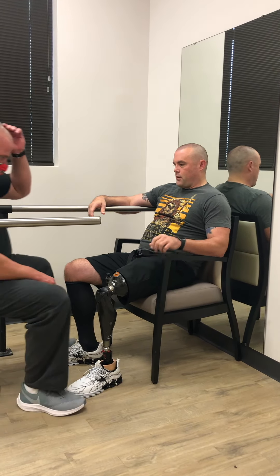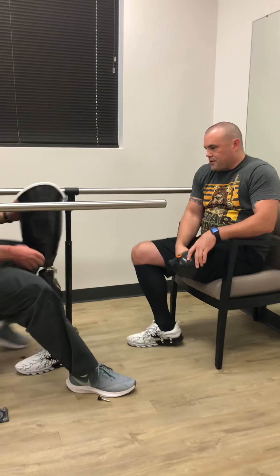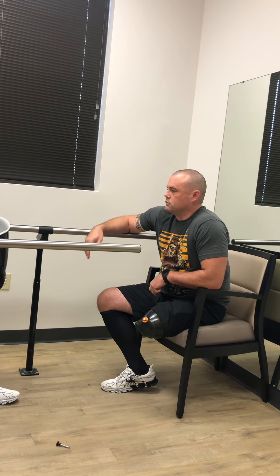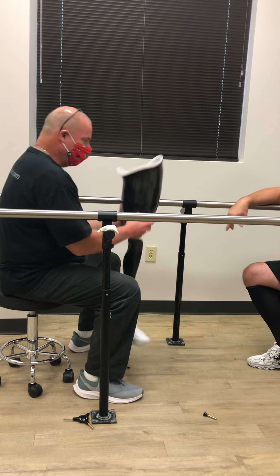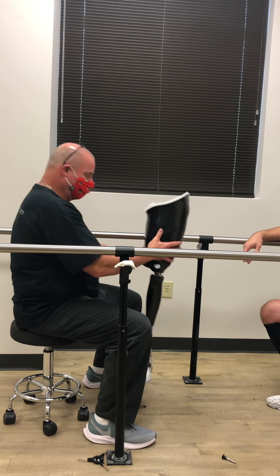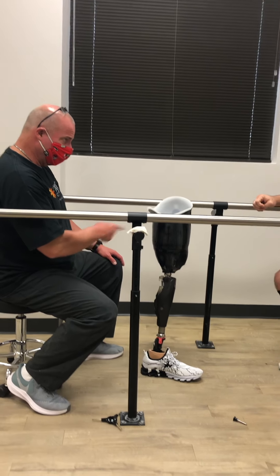You've got to take the shorts off or get it off. All you do is pop the pin and then it'll come out. Normally if you're just getting out of it — hanging out for a little while on the couch — you don't have to come all the way out of it. For 15 minutes, just pull the leg off and set it against the wall. So I'm going to drop the frame in there — I don't know why they insist on having it so high. I'll drop that down now and give you a little bit more room. They keep everything fairly high. I don't start taking material off until I start fitting with you — hook up the foot, get into it, and then bring it in and we'll program it.